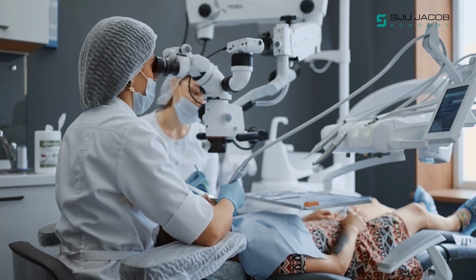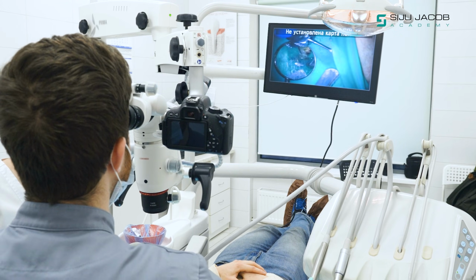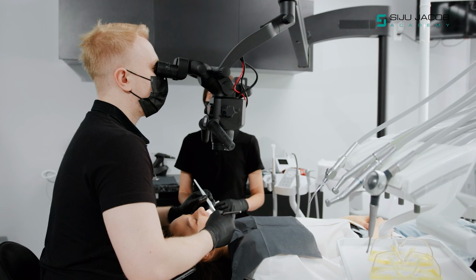Because remember, we dentists are creatures of habit, and once we get used to a certain way of working, when you bring this huge device into your operatory, unless you know how to incorporate it and you are aware of how to use it for everyday clinical procedures, it becomes extremely difficult to use this tool in everyday clinical practice. And that's why a lot of people struggle.